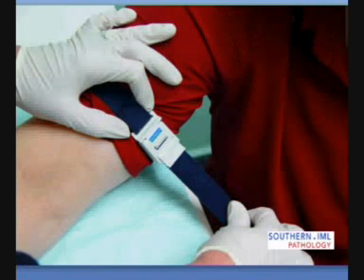Once you have blood flow, loosen the tourniquet by pushing upward. At any time during the collection, you can pull the end of the strap to tighten it if required.